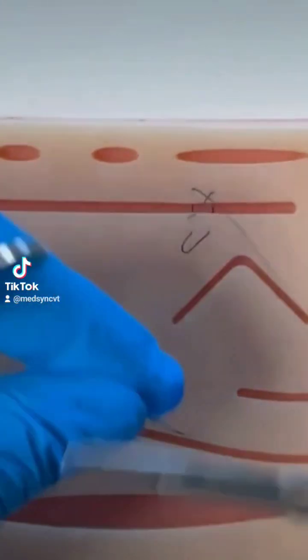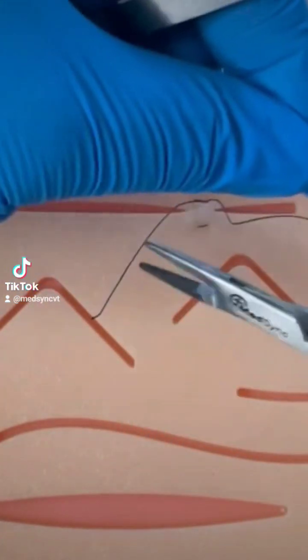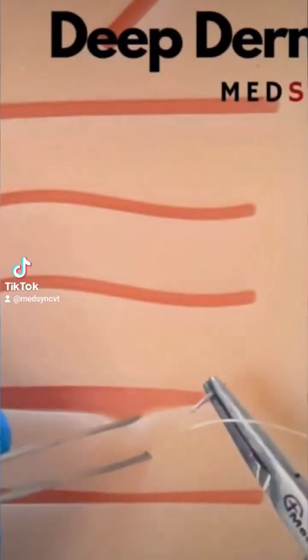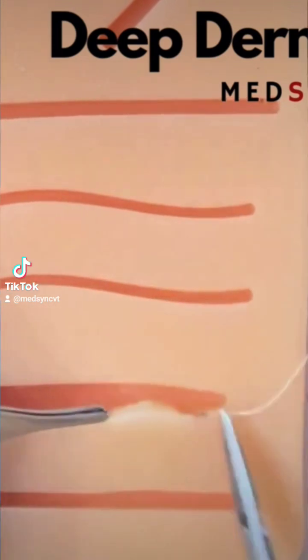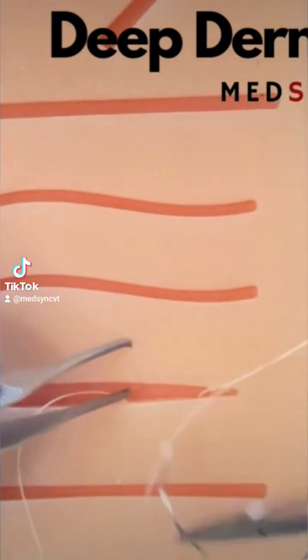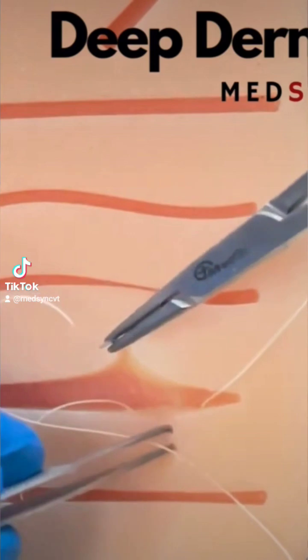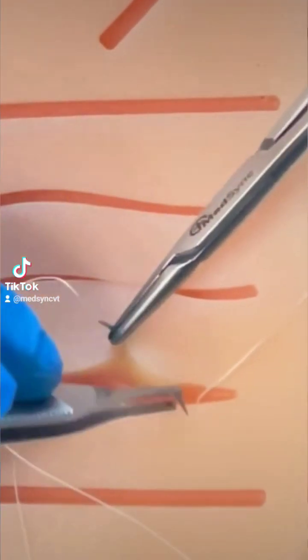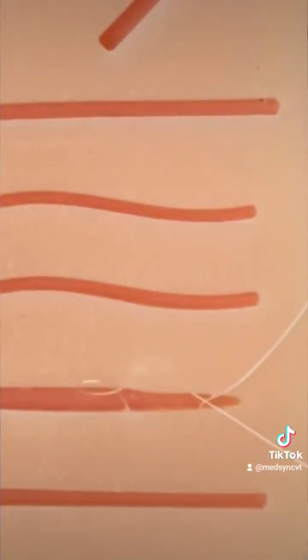This technique is good for wound eversion and can also be helpful for eliminating some tension. The deep dermal technique buries the knot once it is tied. You start deep and exit superficial on one side; on the other side you enter superficial and exit deep. At no stage does your needle or suture material come through the epidermis.